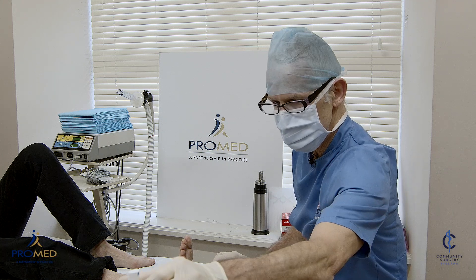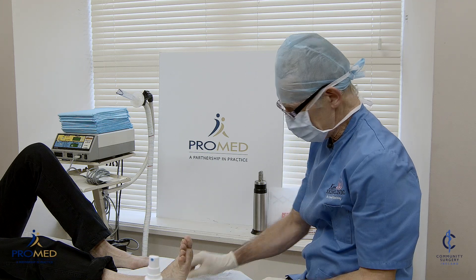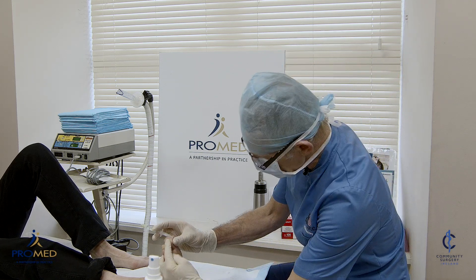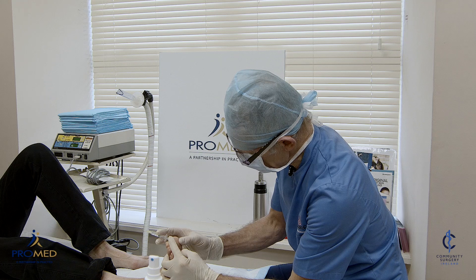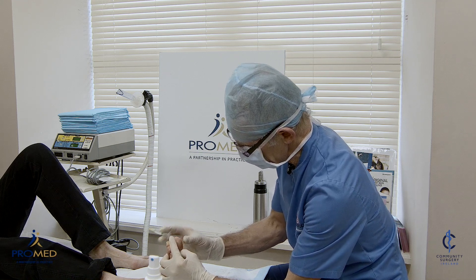I've just cleaned the skin with a bit of chlorhexidine and a little bit of methylated spirits. The adrenaline helps to reduce some of the bleeding. So you're going to feel a small pinch here now. Try not to jump. This is a bit uncomfortable, this part, but the rest is going to be quite easy. Just making a bit of pressure there.